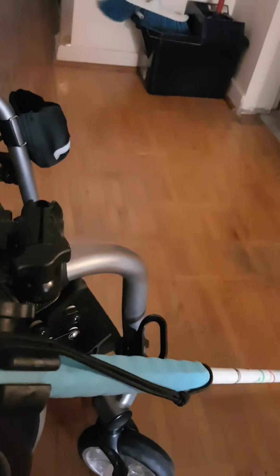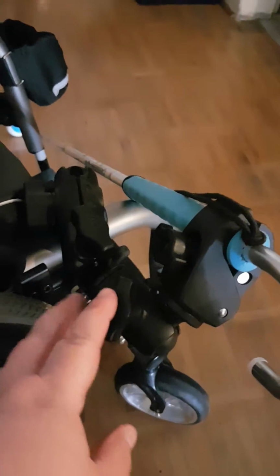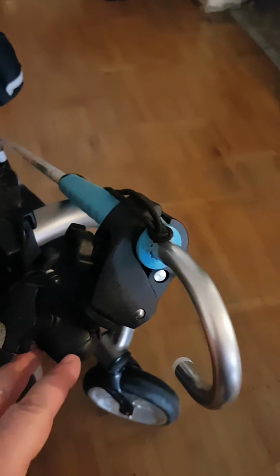Here's what I did. So I've got one clamp on my white cane. This clamp is called a Tough Claw clamp. Okay, there it is. And at the bottom there's a ball. It's a 1-inch rubber ball. And that ball fits into a socket on a swivel arm. And the swivel arm I'll show you in a couple minutes. But so that's the Tough Claw clamp.